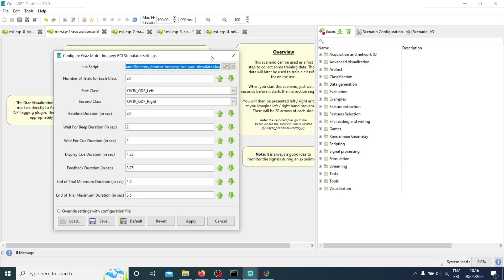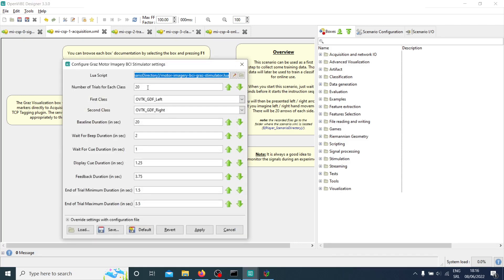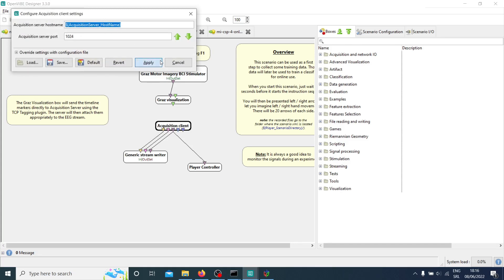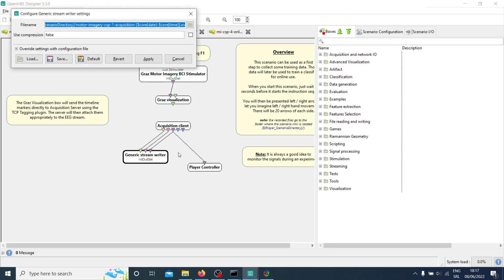In scenario number one, we have the typical Graz BCI interface. You'll see a cross appear, then an arrow pointing left or right, and you tell your participants to imagine left or right hand movement. You can choose how many trials you have for each class — in this case each hand for motor imagery. You can also change the feedback duration. Leave everything by default. The acquisition client here is important — you need to receive the data you're collecting from the EEG device.